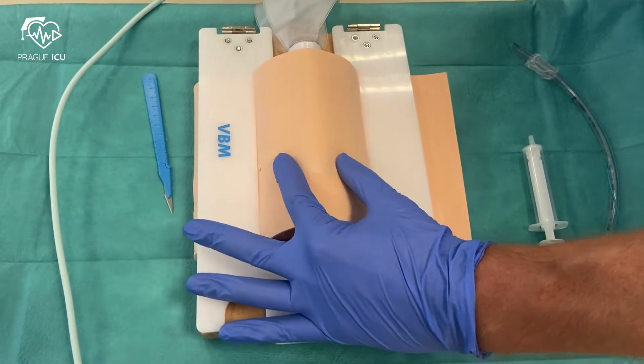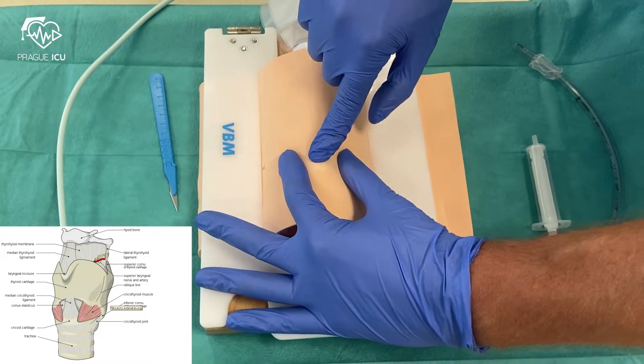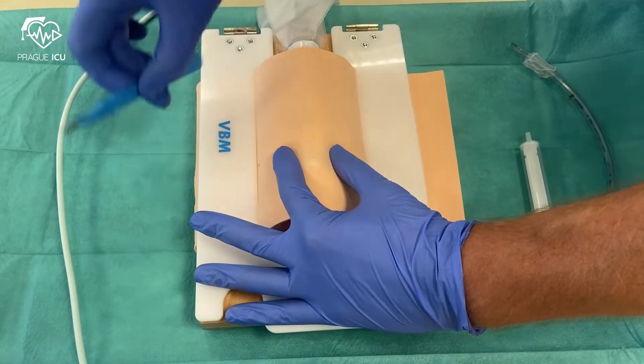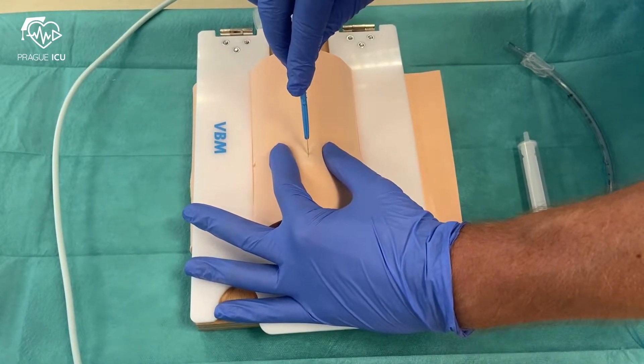Before cricothyrotomy, hyperextend the head of the patient. Locate the cricothyroid membrane by palpation of the depression between the thyroid and the cricoid cartilage. First stabilize the neck and make a two to three centimeter vertical incision.